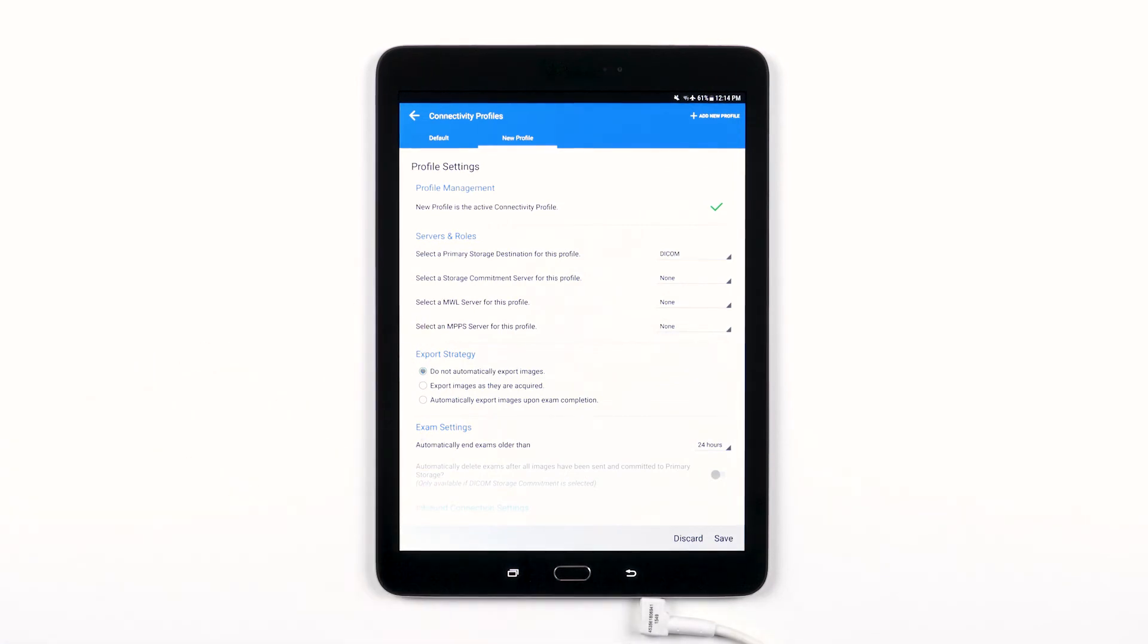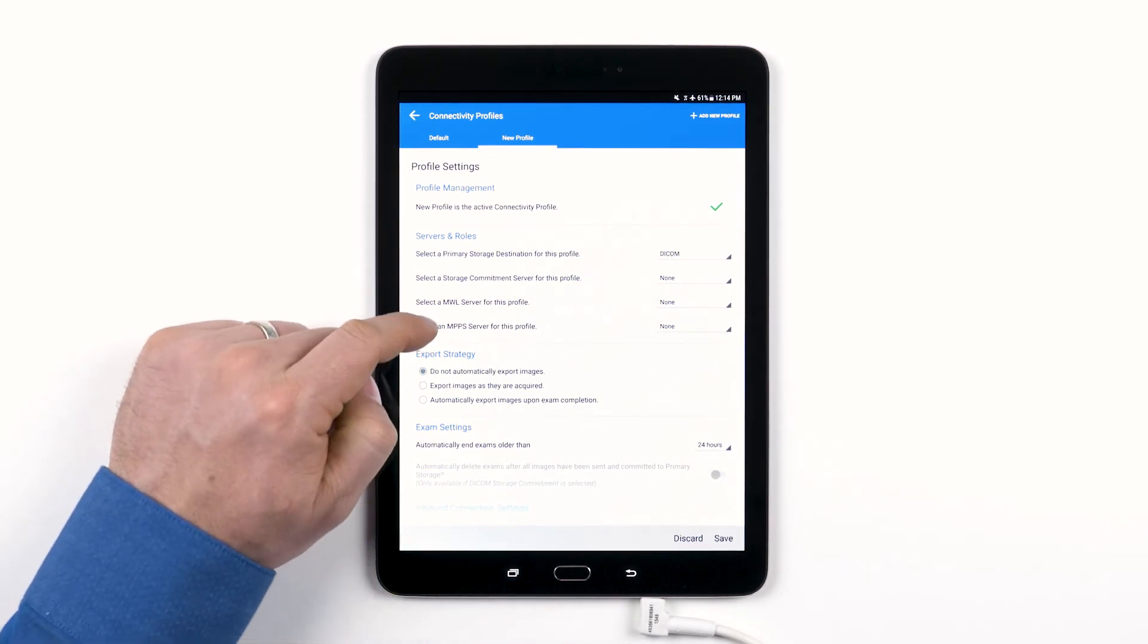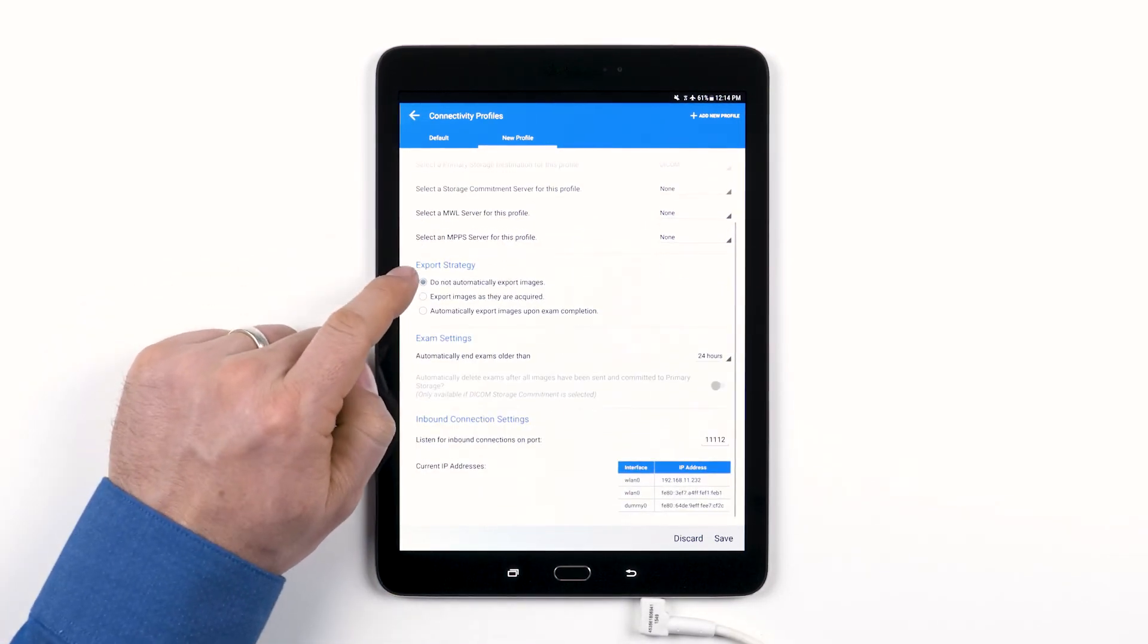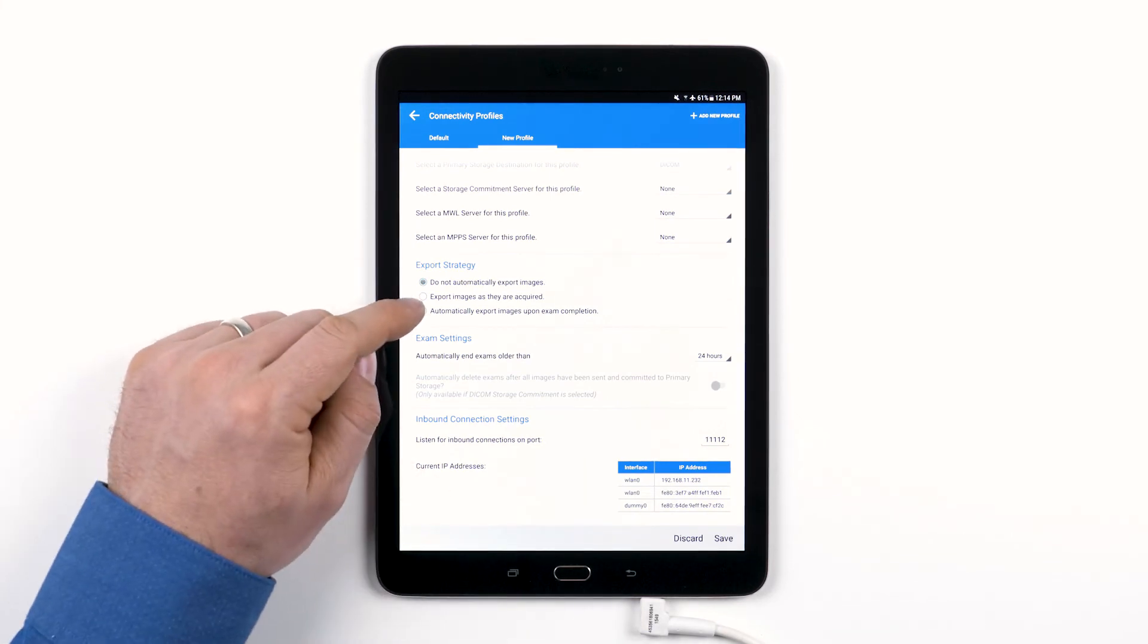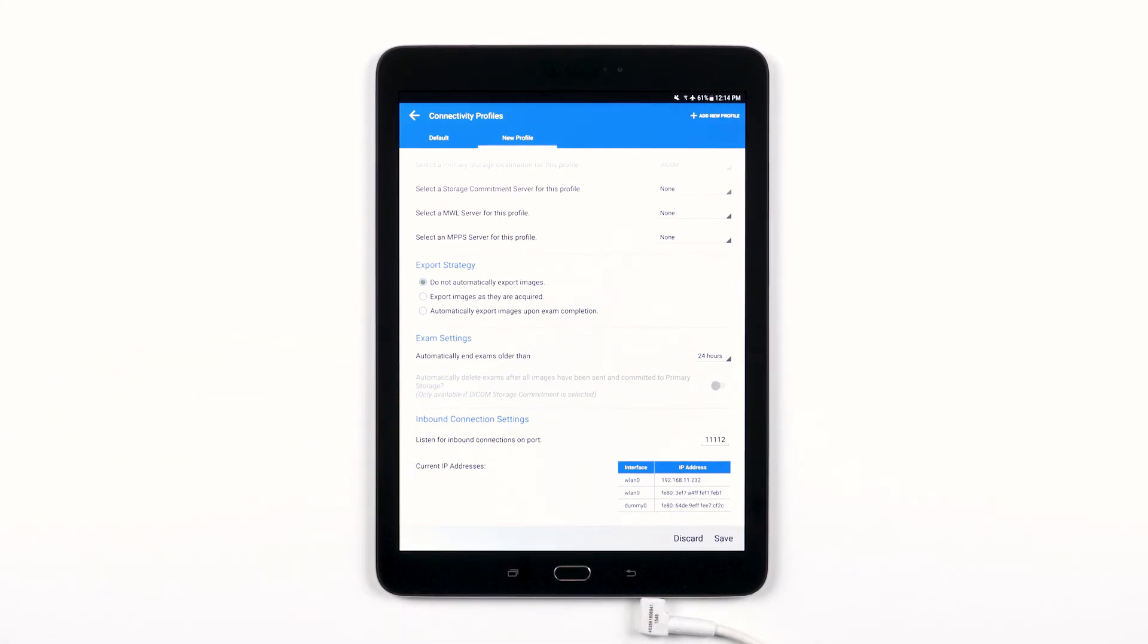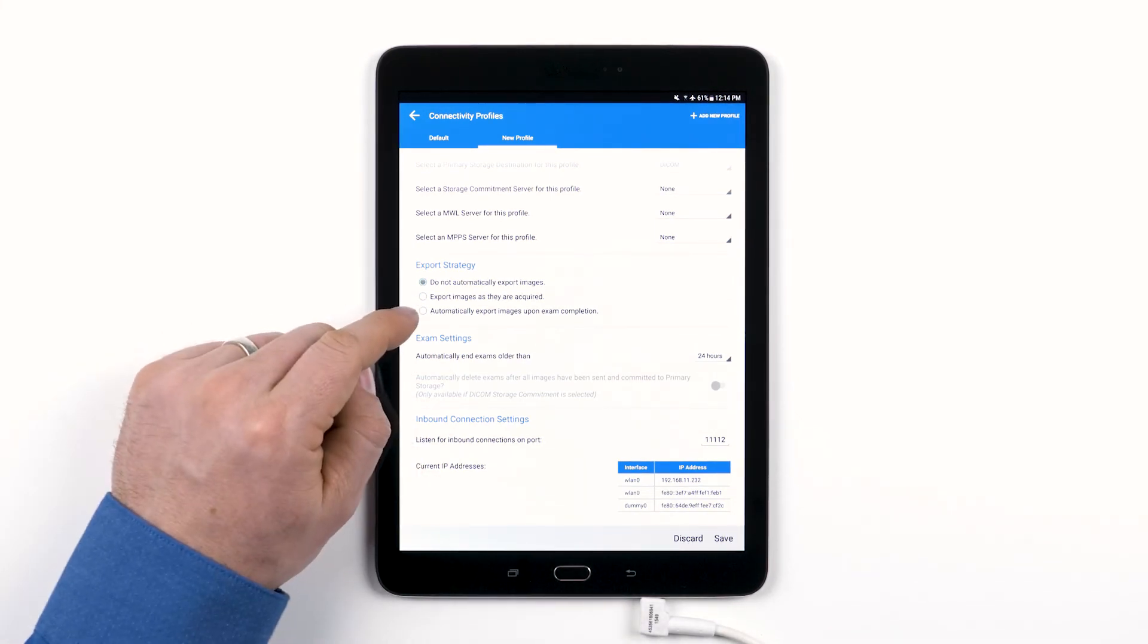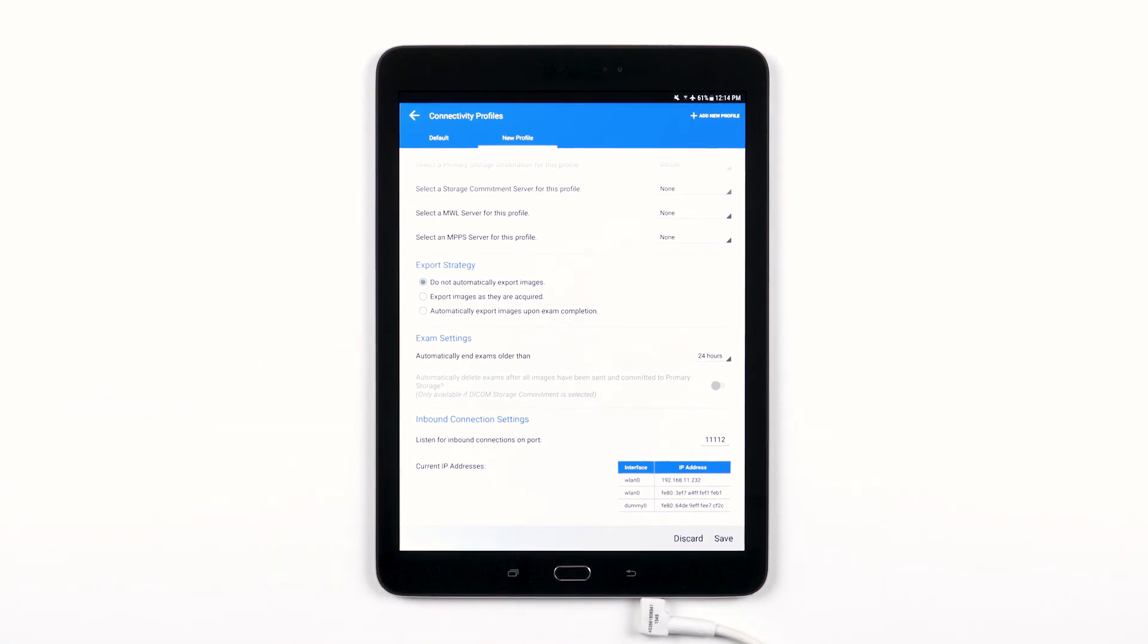The next section is where you set your export strategy. You can choose to not have images automatically exported, you can choose to export the images as they are acquired, or you can set it up to automatically export images upon exam completion or once you've ended your exam.